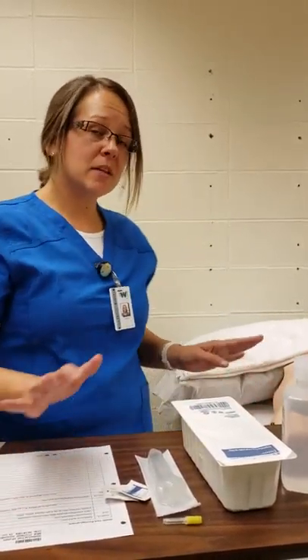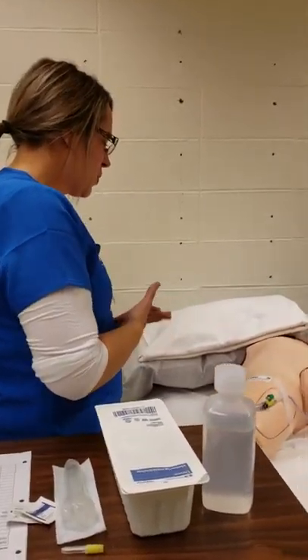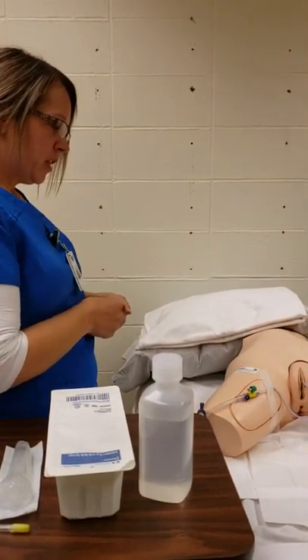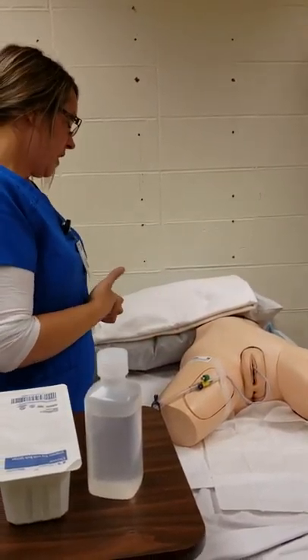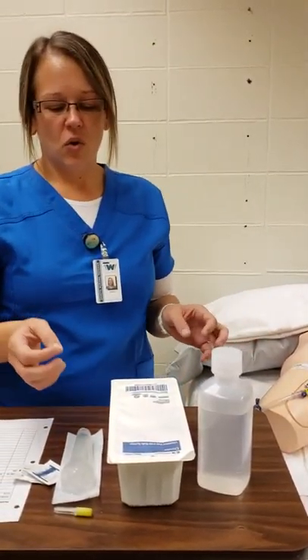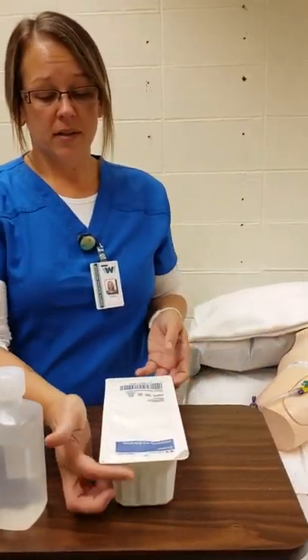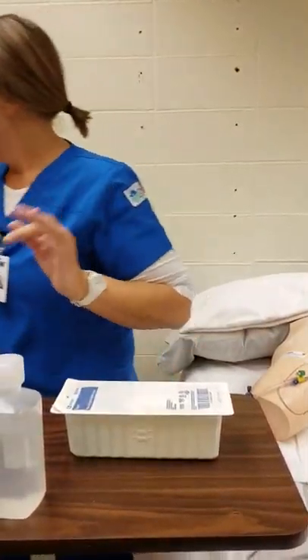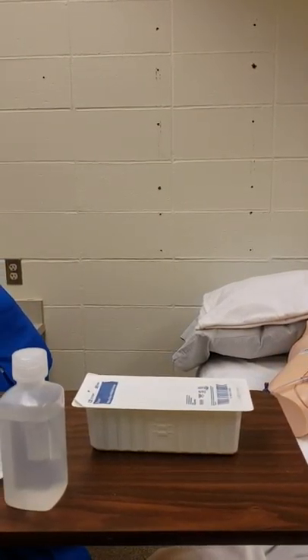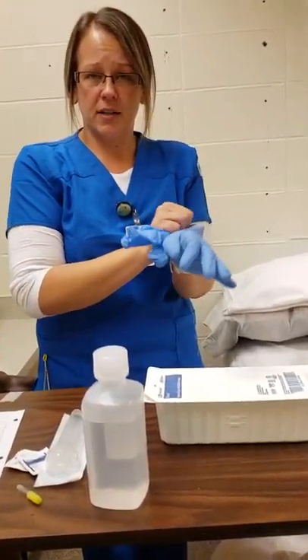I would have been outside the room, then go back in to verify my patient's name, date of birth, and check for allergies. I provide patient privacy. I reintroduce myself: 'Hi Shirley, I'm Toni. You have an order to irrigate your catheter with 30 mL of saline, so I'm going to do an irrigation for you today.' I've checked my orders and we're going to make sure everything is open. This is a clean procedure, not a sterile procedure, so I do my hand hygiene and put on regular gloves.